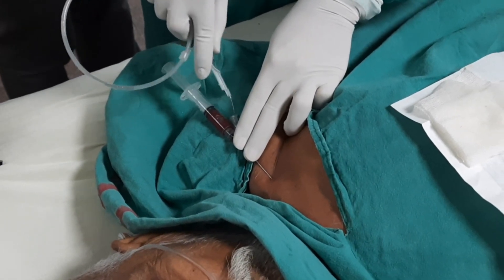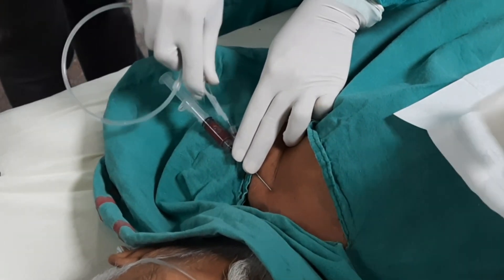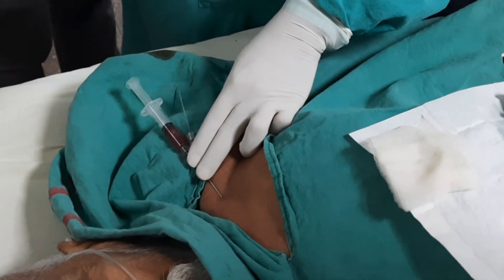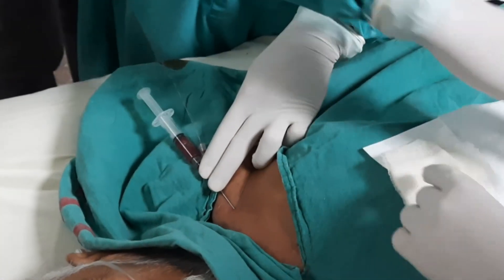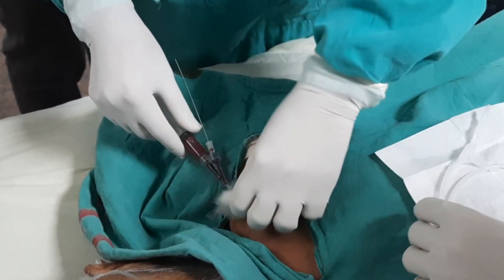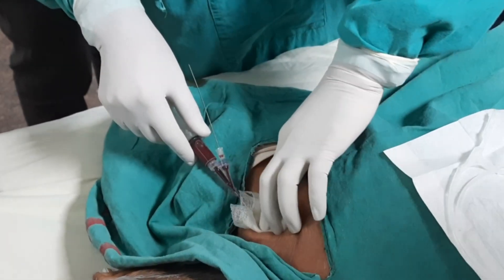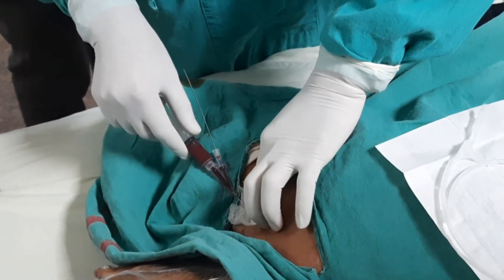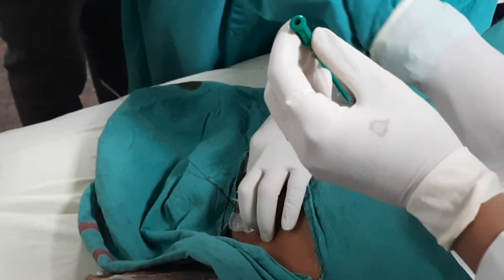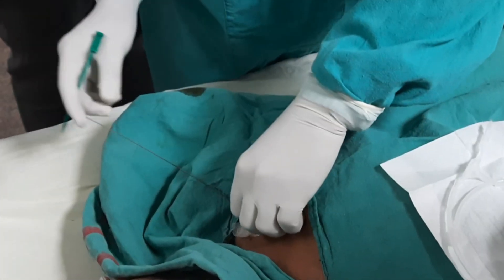Once blood comes, keep the bevel downwards. Now we will insert the guide wire through the side port, pushing gently. We should not force the guide wire, otherwise it will damage the artery or vein. Now we will take out the needle gently, taking care not to remove the guide wire.